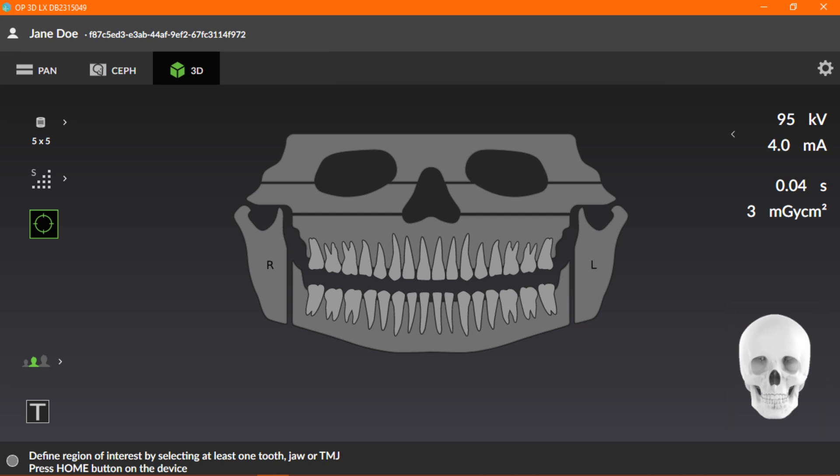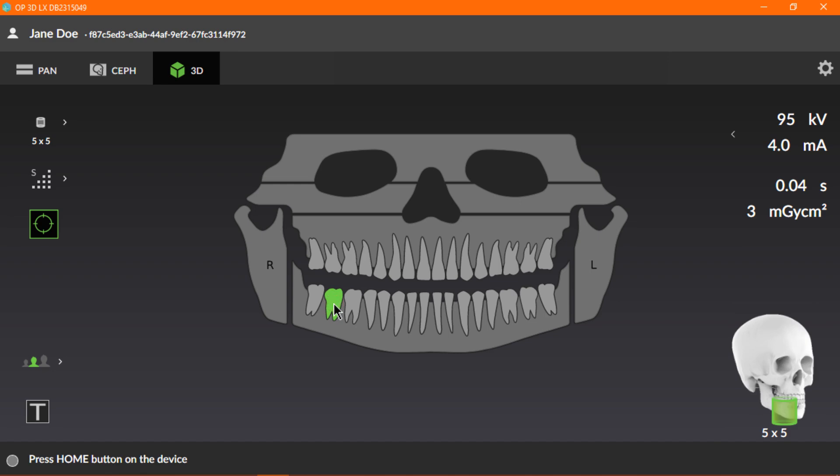You can select the teeth or region, such as a single tooth, or a range of teeth.